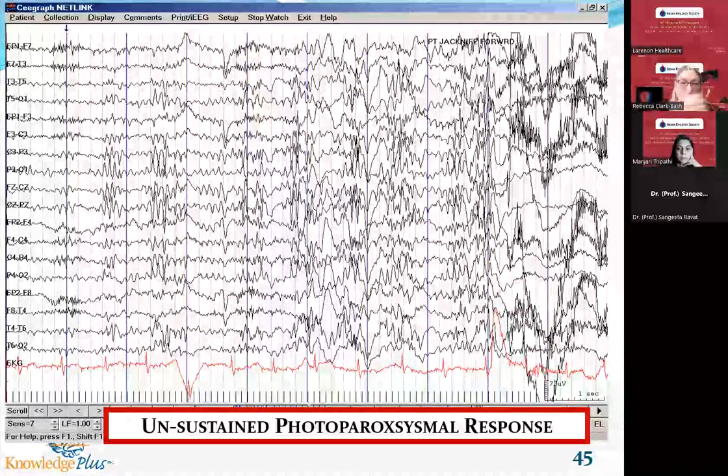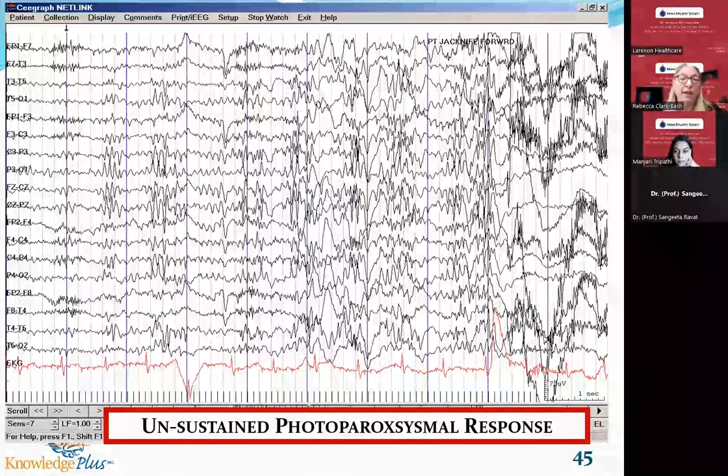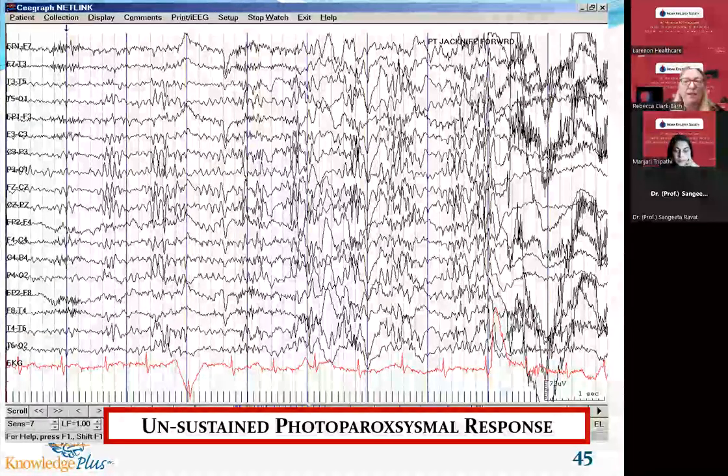When you're in restraints and you're having a seizure, he could easily have broken one, if not all, of his arms and legs. So I'm standing behind her, but I am the tech and I am looking at the patient. And at this point in the third second, he's shifting a little. You see the movement artifact down in the EKG lead. He's just moving a little bit. And to me, I'm thinking he doesn't feel right.